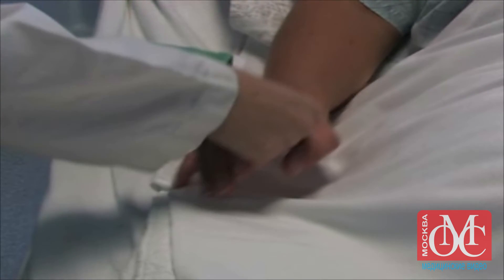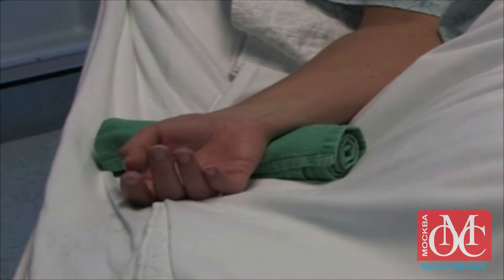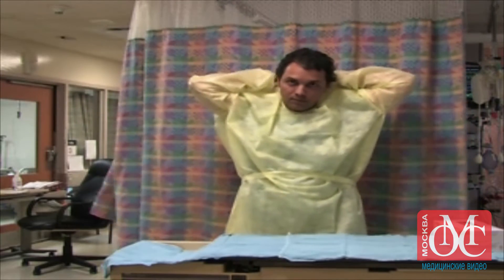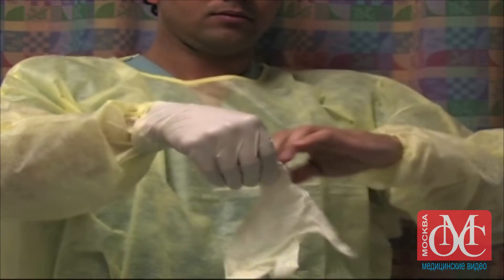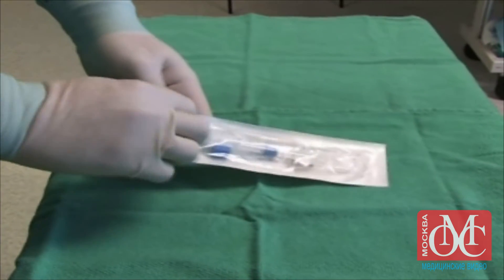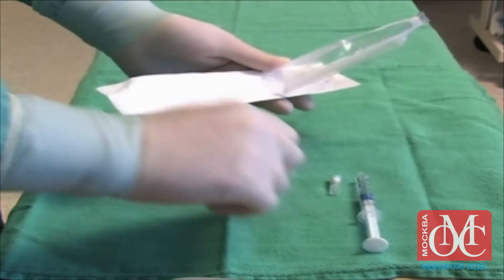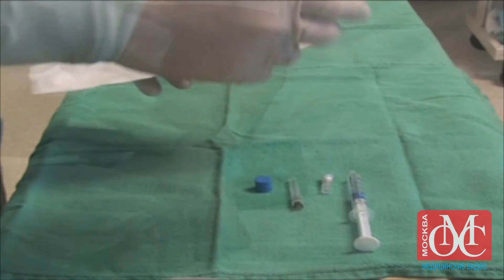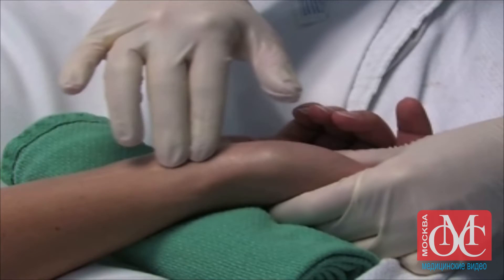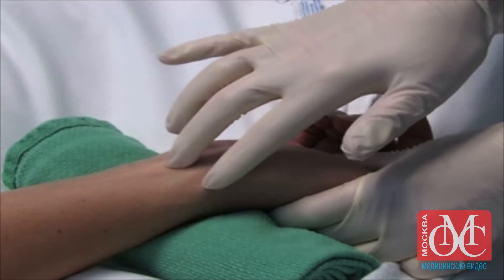Extend the patient's wrist and place a rolled towel under it to maintain it in an extended position. Once the patient's wrist is positioned, put on a non-sterile gown and non-sterile gloves. Open the arterial blood gas kit and identify all the components so they are ready for use. Clean the site with an alcohol swab. Palpate the radial pulse and determine the point of maximum impulse, or use the Doppler ultrasound device to identify the location of the radial artery.